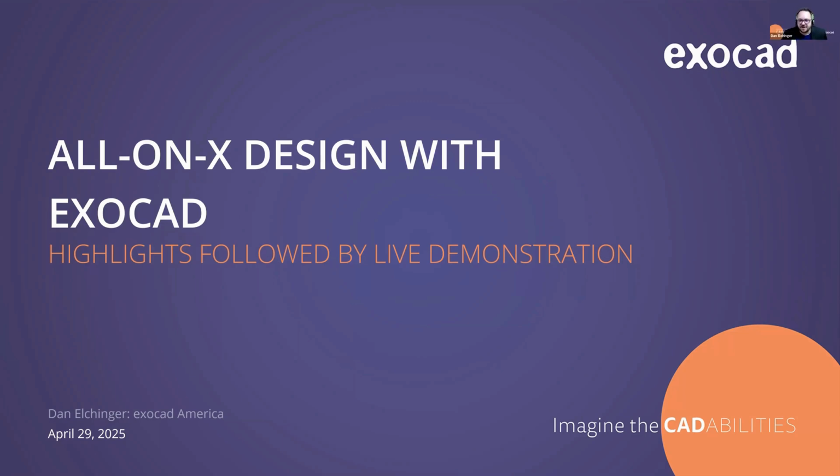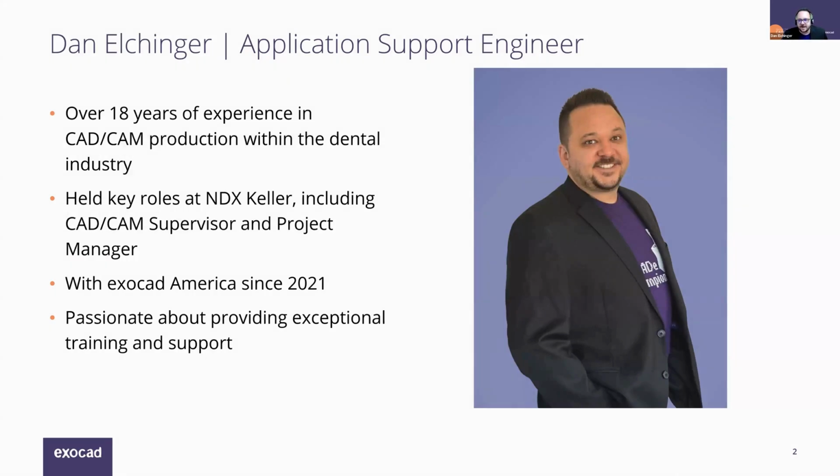All right, thanks, Fran. So welcome everyone. Today we're going to cover All-on-X design with exocad. Proceed forward here. So we're going to go through a brief PowerPoint.